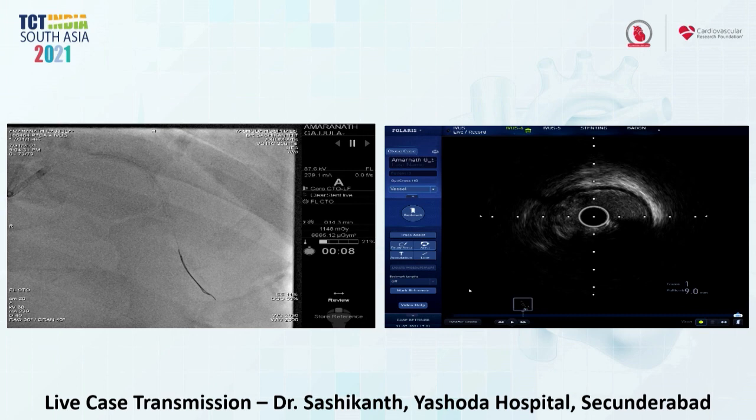Albeit, I think the point is very well taken because of the difficulty of leaving an IVUS catheter jailed. But because we are very close to the ostium and we have a circumflex lesion that needs to be fixed, we needed to be extremely precise. The margin for error was minimal, and that's why I thought we had the absolute confidence that we are a little off the ostium by the position of the eye of the IVUS catheter.